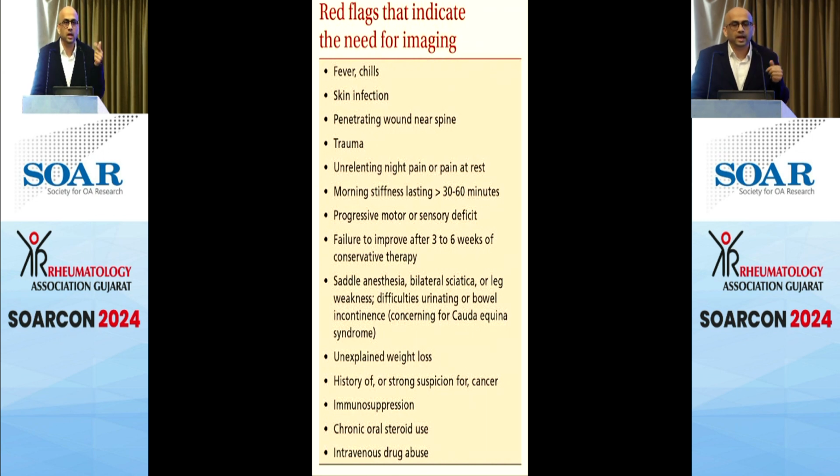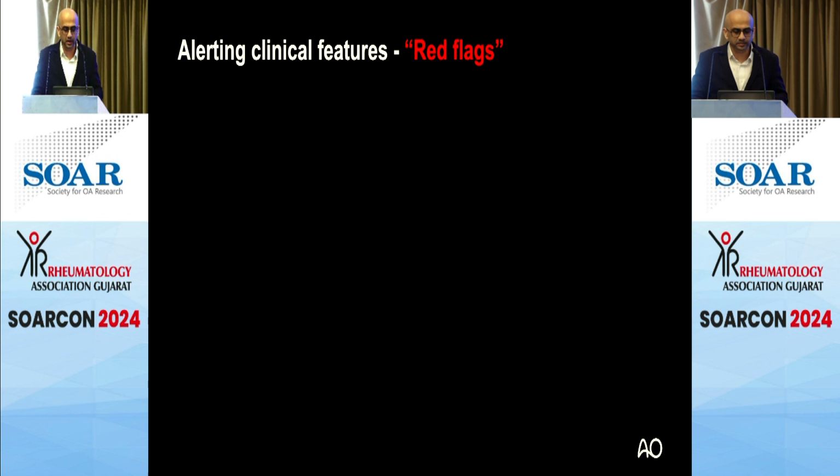The second purpose is that your clinical diagnosis is a neurological concern, meaning radiculitis, radiculopathy, or neurogenic claudication, and you are looking specifically for a correlation of that neurological symptom with the MRI. So these are two broad reasons why you would get an MRI done.